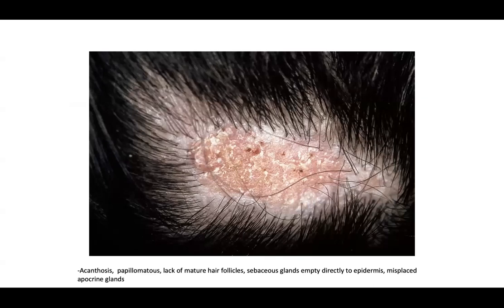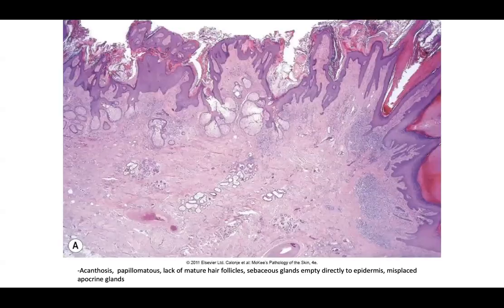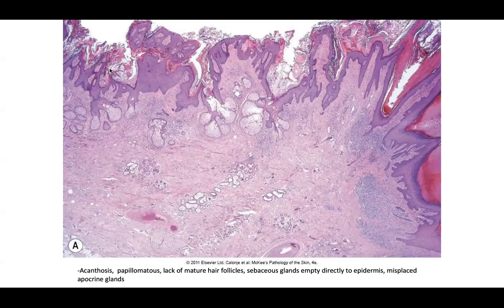Here you can see a nevus sebaceous. On the slide you'll see acanthosis and papillomatosis corresponding to that bumpy architecture on the outside. There's a lack of mature hair follicles, and sebaceous glands empty directly to the epidermis. That's an important point: when you see those sebaceous glands directly contacting the epidermis and not associated with a hair follicle, think about nevus sebaceous. Misplaced apocrine glands are also a feature. The clinical and histopathology line up really well — no hair follicles explains the alopecia.